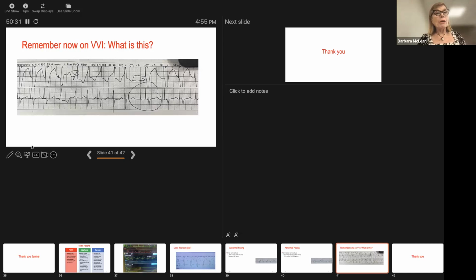It's very hard for me to say that my pacemaker is functional. I actually think this patient has pacemaker failure, and I think you have abnormal spikes. I think you have failure to sense. I think you have failure to capture. That's considered pacemaker failure. Because it's a permanent pacemaker, we can't do anything about it, except we are going to assure that our patient's electrolytes are stable. We are going to assure that we have tight limits on his monitoring.